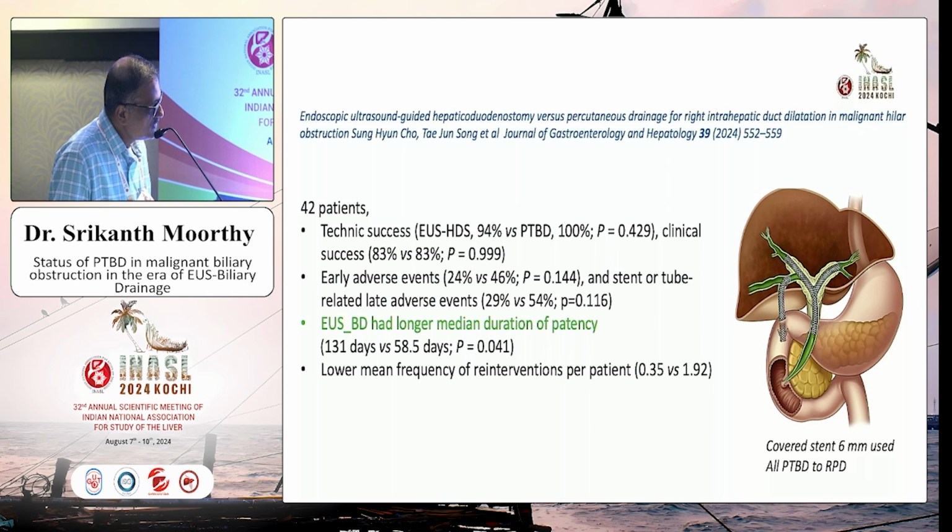And in these patients, just to make sure that the comparison is perfect, they did all PTBDs to the posterior duct. But the point is, with PTBD, the advantage is you can drain any duct or you can do multiple ducts also. And draining the anterior system from this position with EUS is still a bit of a challenge. But for PTBD, that problem is not there. But the point I'm making is overall, even in places where they don't have much experience, they're all evolving, the comparison is very good. It's just about as good as PTBD with some advantages.